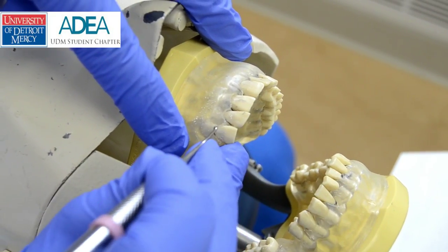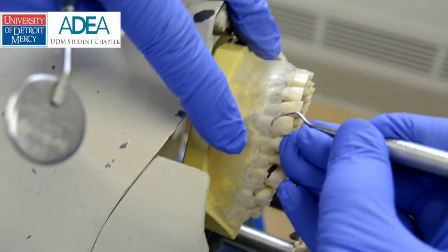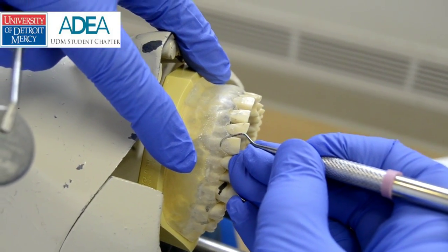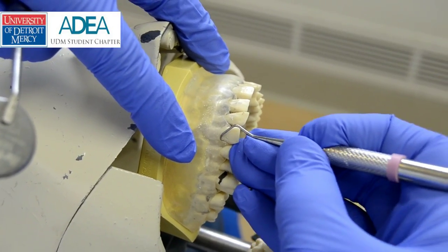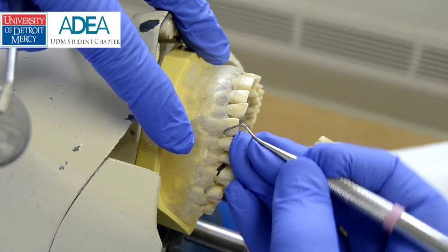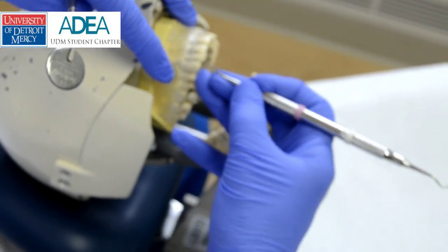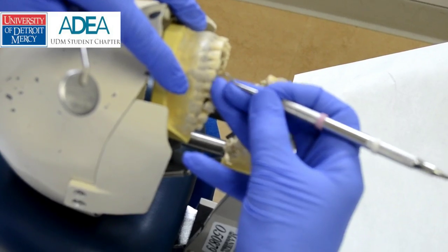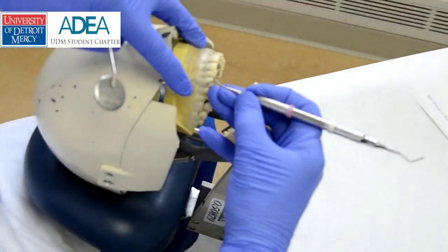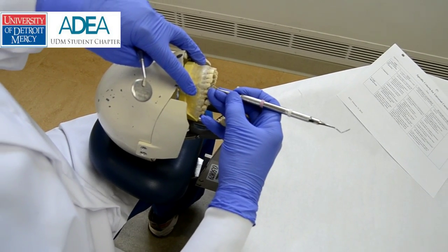This would be open, this would be too open — I need to engage the cutting edge against the tooth, so we want to maintain that cutting edge against the tooth. Then rolling to the inner proximal. My finger motion does not create the stroke, and sliding on my ring finger does not create the stroke. Keeping these all together as a unit and rocking on that fulcrum — that's what will create the stroke.